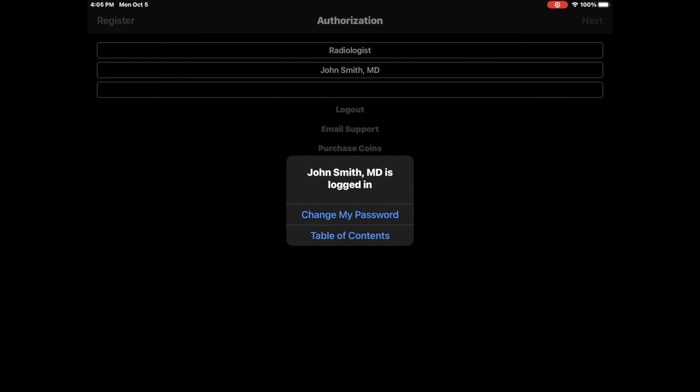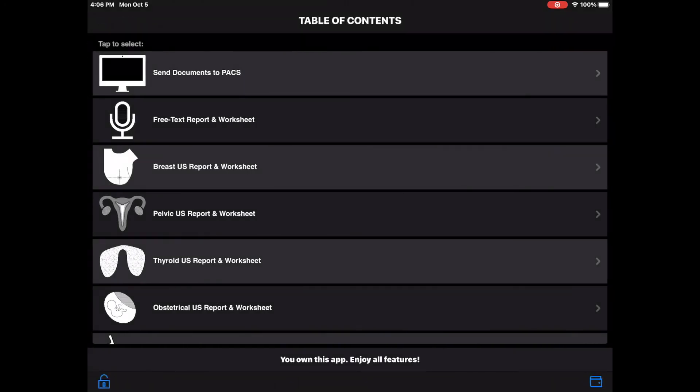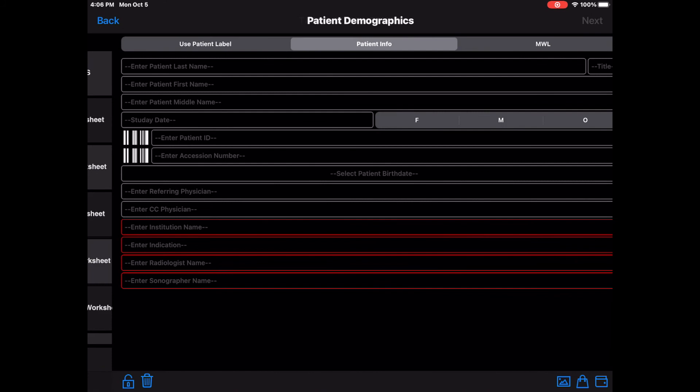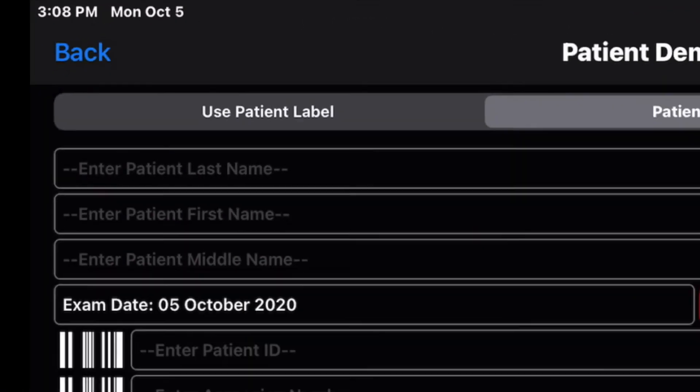Go to the table of contents and select a topic. Select Use Patient Label.